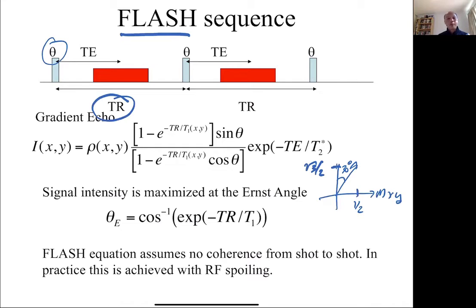So typically, for example, when you have an MR exam, the first scan you have is what's called a localizer exam. That is just trying to get very quick images of where the brain or the body is located, such that the remainder of the exam can be prescribed and the slices can be put onto those localizer images. So the intuition behind this is similar to what you might have if you had a flush toilet, okay?